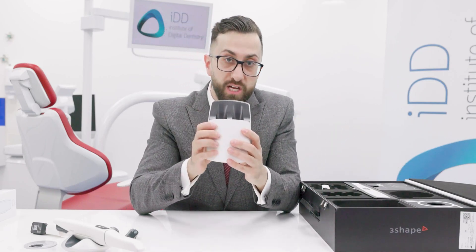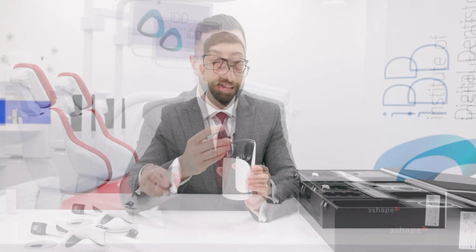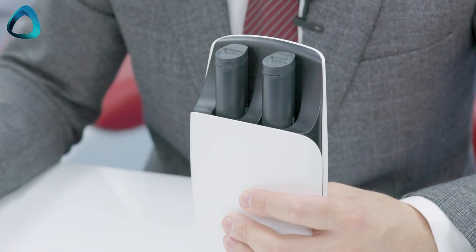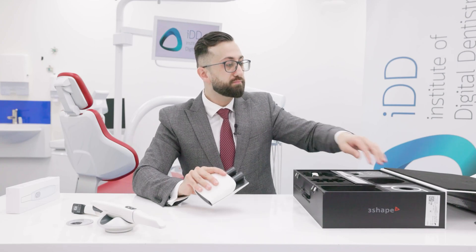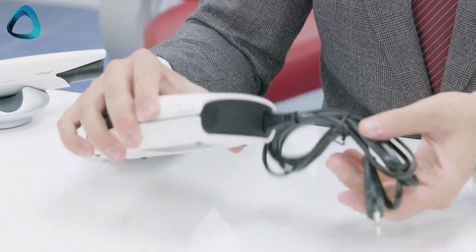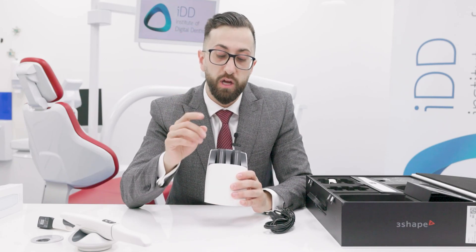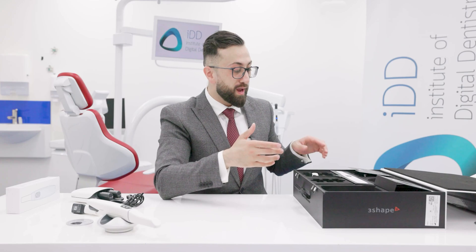In the box there's also a charging station, very similar to the old Trios 4 charging station — you simply put the batteries in. It's a dual charging station, so you can charge two Trios 5 batteries at the same time. The company has also innovated in the charging department by enabling fast charging: charge for one hour to get up to 80% battery life, or two hours to reach 100%.